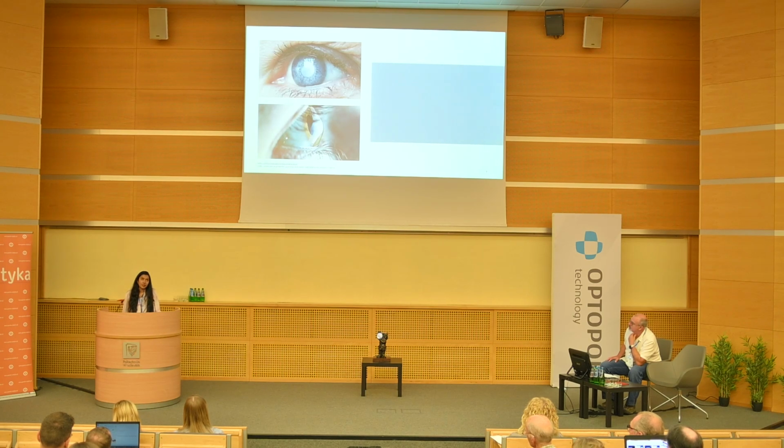In order to correct keratoconus, there's spectacle correction if it's in the early stage, and if it's mid stage, there are rigid gas permeable contact lenses. Because of the astigmatism in keratoconic eyes, most of these corrections are toric corrections. And when it comes to IOL correction, there is also an assumption that toric IOLs can be used to correct keratoconic eyes.